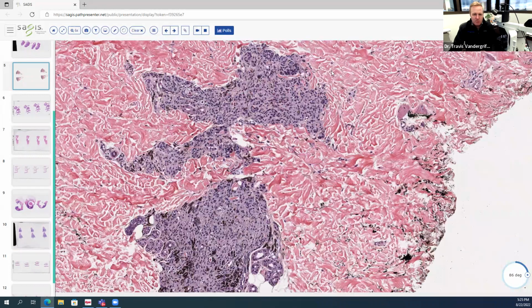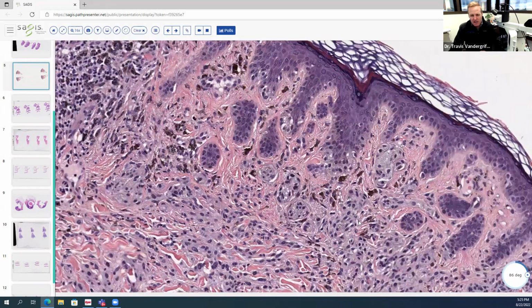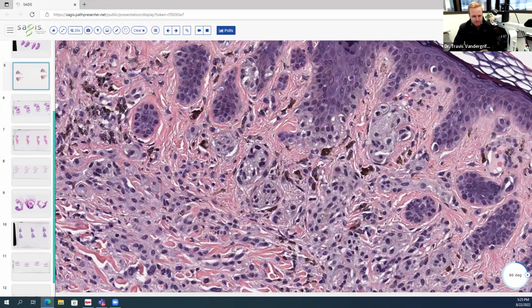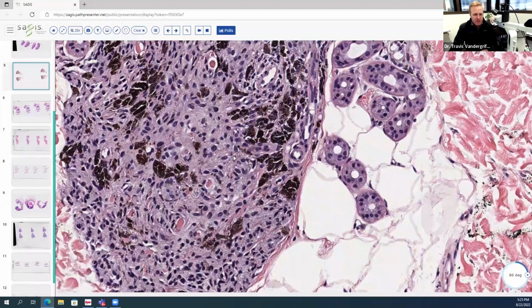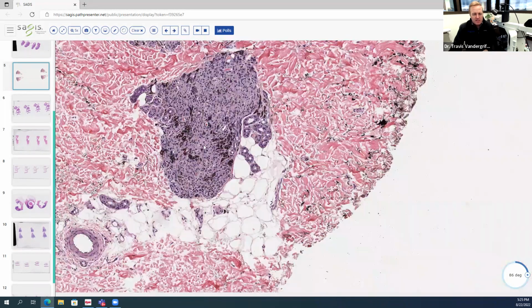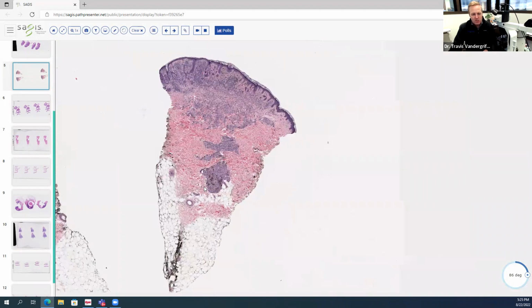The melanocytes at the superficial part look a little bit more like your conventional melanocytes. They have nests forming here in the papillary dermis, not quite as much melanin. And then as you get down here, you've got this specific cytological appearance with the gray cytoplasm and the finely divided melanin. So that is a deep penetrating nevus, and on scanning magnification, it's going to give you this wedge-shaped, deeply penetrating or deeply extending silhouette.